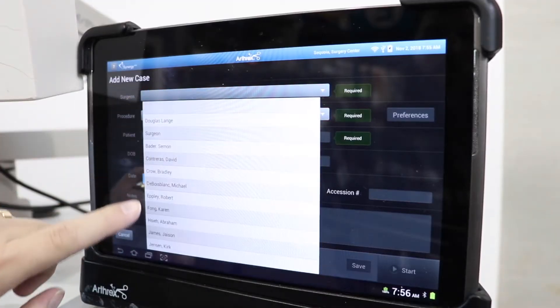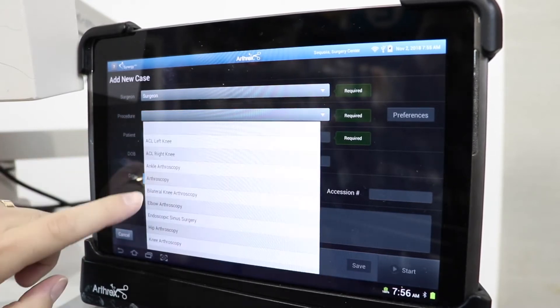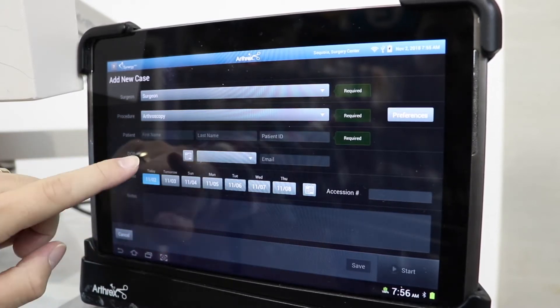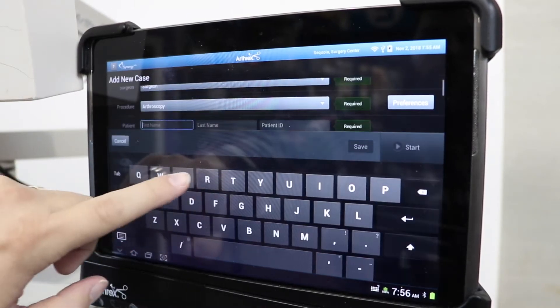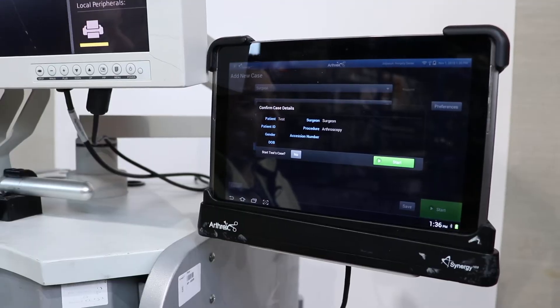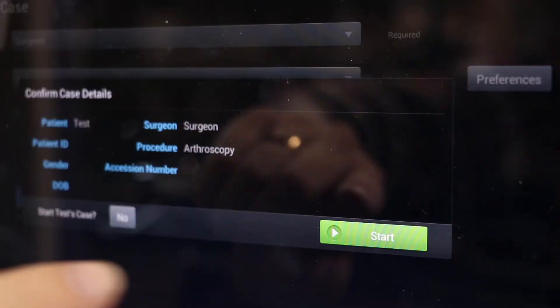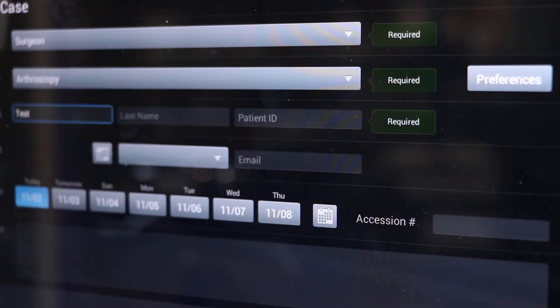Once you're ready to start the procedure, you would have to type in all of the information. Our patient is test, surgeon is surgeon, and the procedure is arthroscopy. Those are fully programmable to have drop-down screens for surgeons and procedures, and then you would manually have to enter the patient's information in. Once you do that, you go ahead and hit start on your tablet.